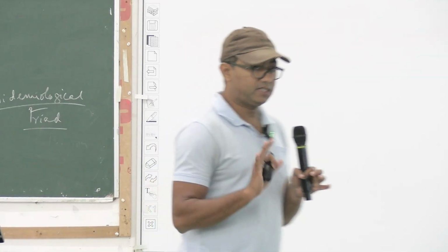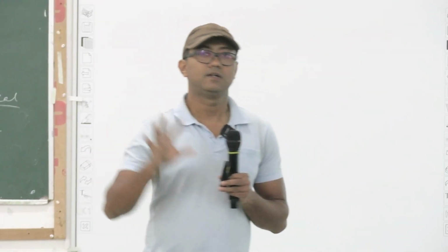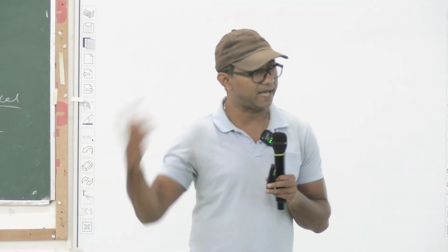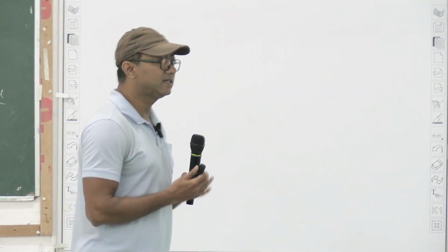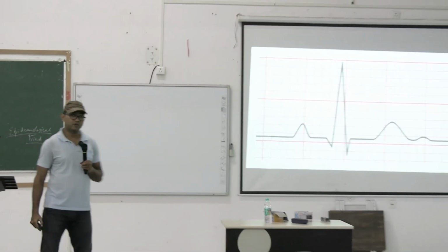So, conventionally all ECG machines are the same throughout the world. Wherever you go, to the US, to Europe, to Africa, you will find the ECG leads are conventional. There will be a red color clip, yellow color clip, black color clip, green color clip and the chest leads. On the chest leads it is written V1, V2, V3, V4, V5 and V6, where to put them. It is conventional. And this graph paper is also conventional.